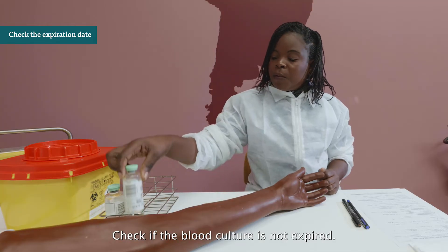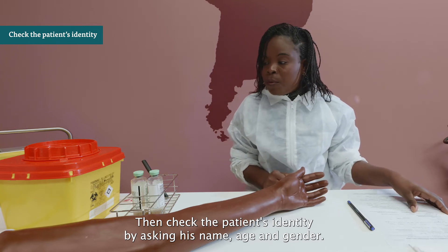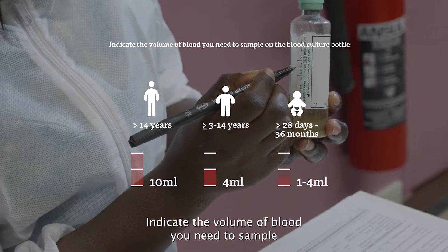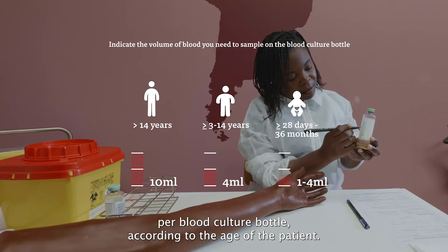Check if the blood culture is not expired. Then check the patient's identity by asking their name, age, and gender. Indicate the volume of blood you need to sample per blood culture bottle according to the age of the patient.